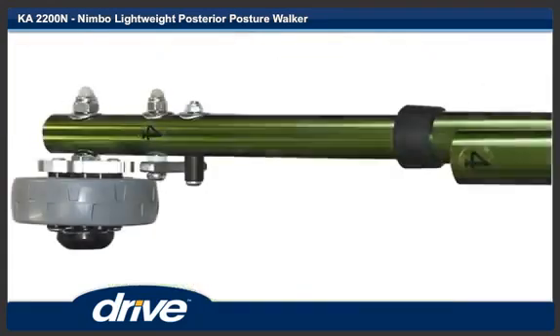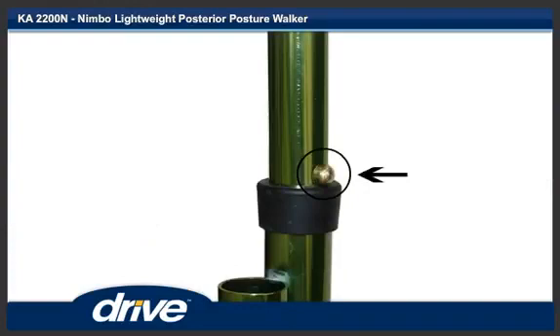Step 6. Insert one of the legs into the corresponding leg tube on the main frame. Step 7. Push the locking pin in and continue sliding the leg into the leg tube on the main frame. Repeat steps 6 and 7 for the other three legs.